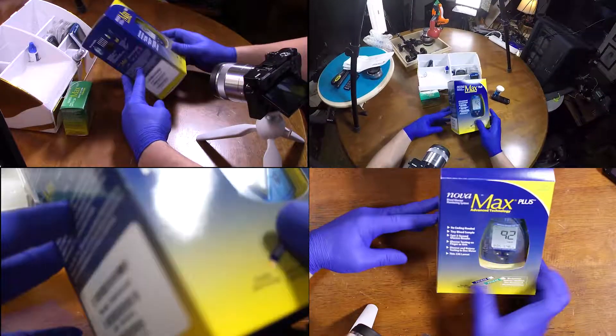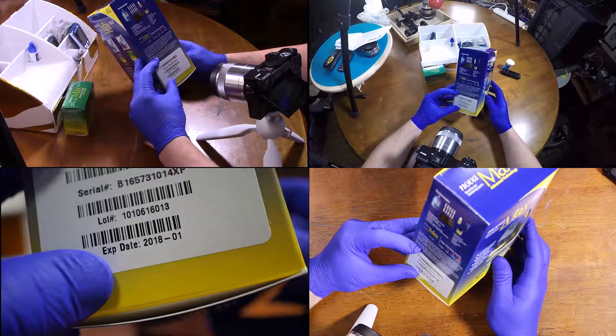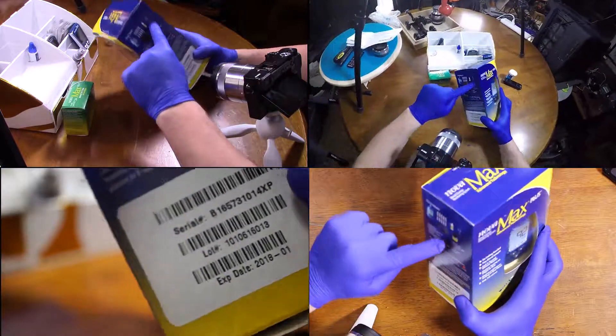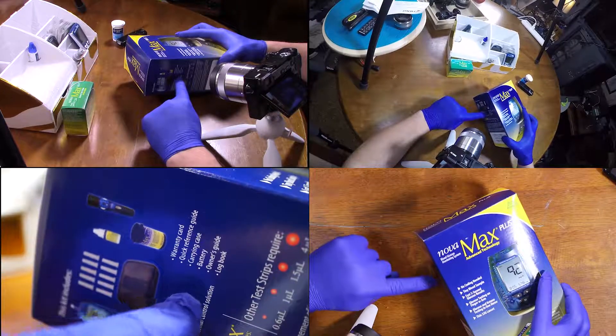Let's go ahead and open up the box first. We have an expiration date of 01-2018. I'm not even sure what that means — that's probably referring to the stuff here, the control solution.